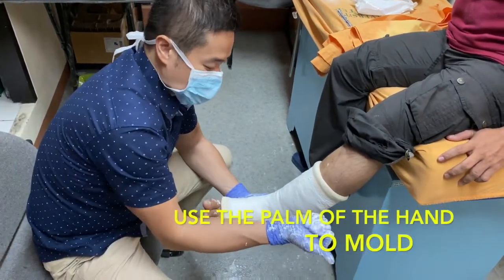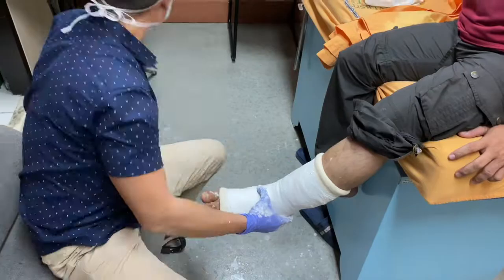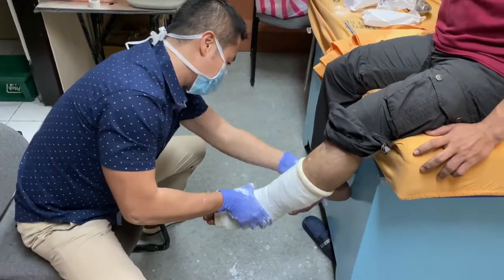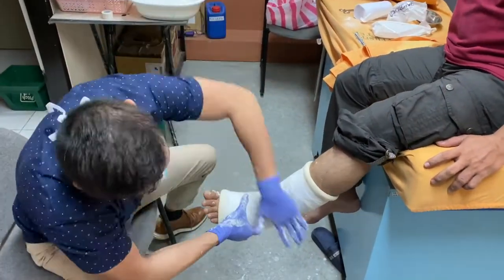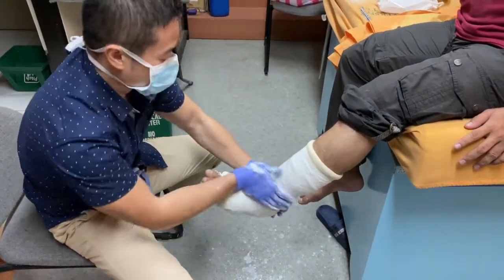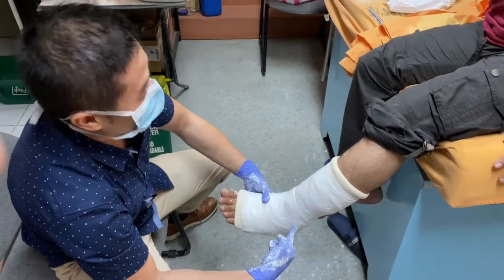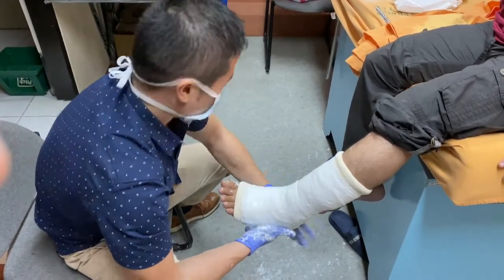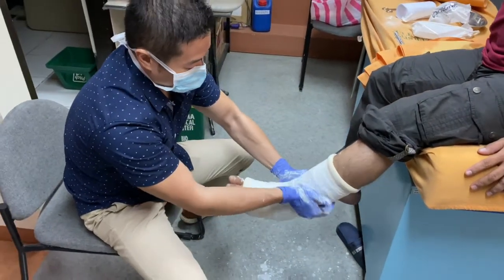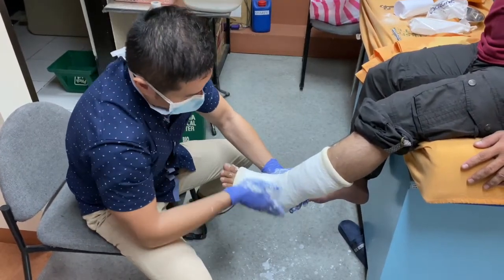The next step is molding. This is how you direct and can actually reduce some fractures, and also dissipate the forces in your cast. Use the palm of your hand to mold — not your fingers. You can also ask the patient if he or she feels any pressure points. There is no risk for ulcerations as long as you apply the appropriate padding.